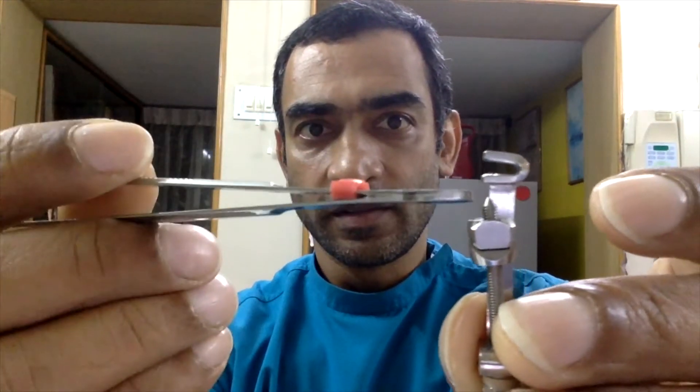So I have in my hand a typical Tofflemire retainer. It consists of two screws — what I call the big screw and the small screw, some people like to call them nuts. These two screws or nuts basically move this little device up and down: the big nut will move it up and down as you screw or unscrew it.